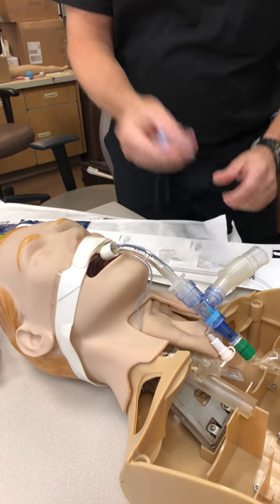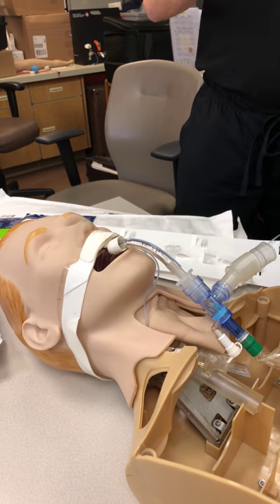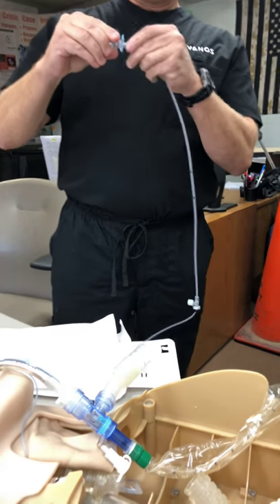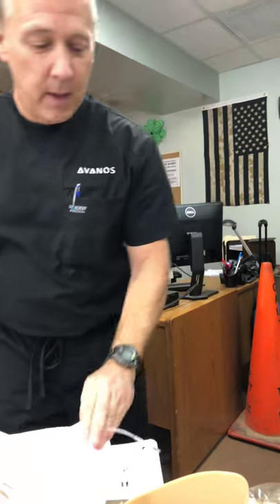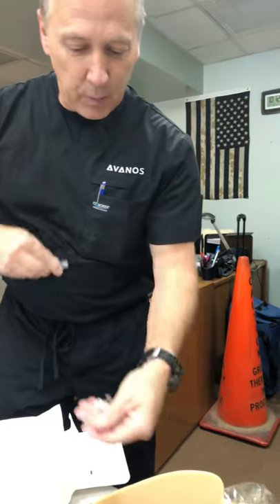We would take our ET tube adapter and we would go ahead and advance it into our ET tube adapter, just to get it past the edge of the cuff so it doesn't get hung up on our ET tube. On the back side of our mini-BAL, we would take our Christmas tree adapter that looks like this, and we would attach it here.